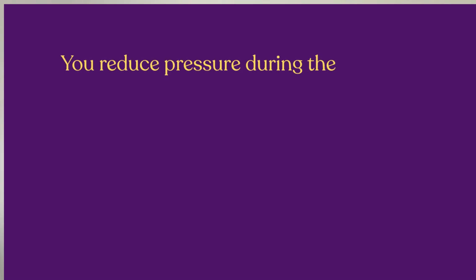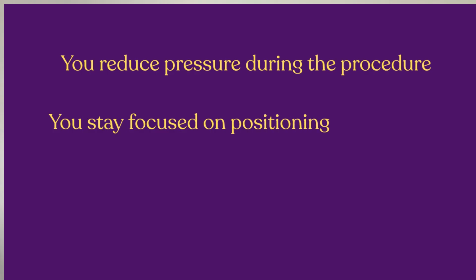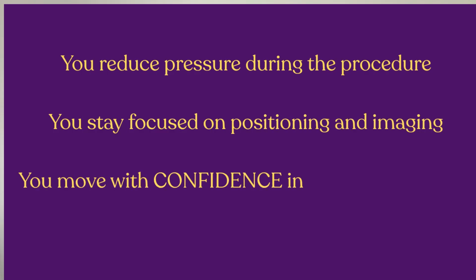When you do this ahead of time, you reduce pressure during the procedure, you stay focused on positioning and imaging, and you move with confidence instead of reacting to chaos. Preparation creates confidence. What you do before the case determines how smoothly everything else goes.